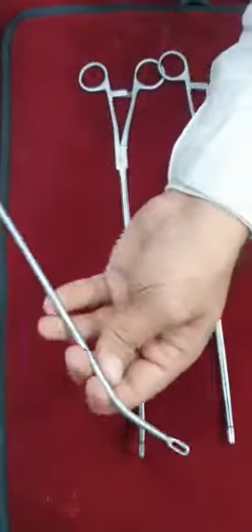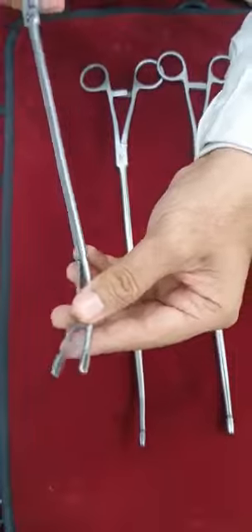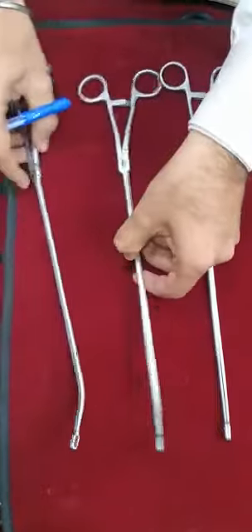I will start with this node grasper. This is an oblong tip, atraumatic in nature, just to take the nodes. This is a 13 and a half inches, 5 mm instrument. I hope you appreciate the teeth.